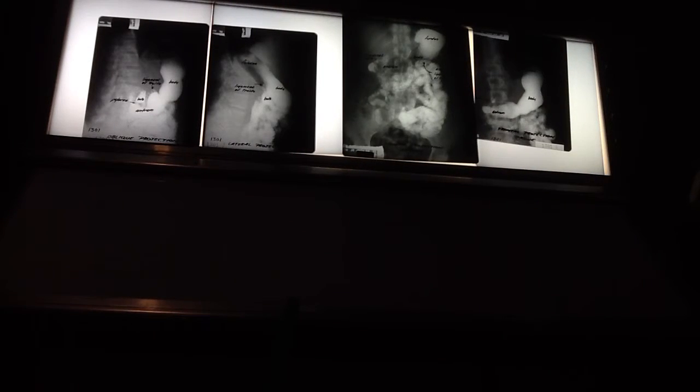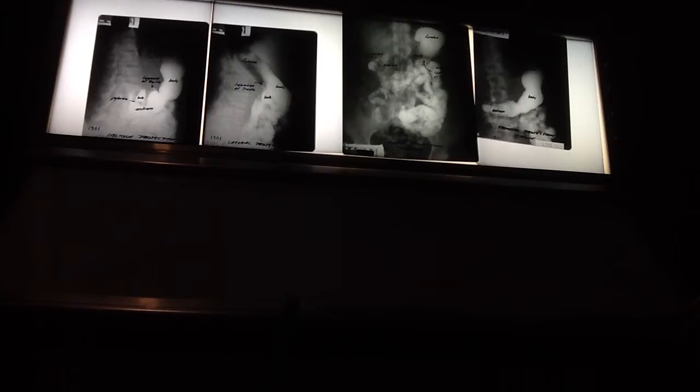One of the things about continuing to do some of these older studies like this, the barium swallowing for the upper GI and then the barium enema for the lower GI, is that when this is going on, the radiologist will watch things as it goes through. So you do it fluoroscopically, all right? So that you kind of watch the things go through, especially with the barium enema, okay?